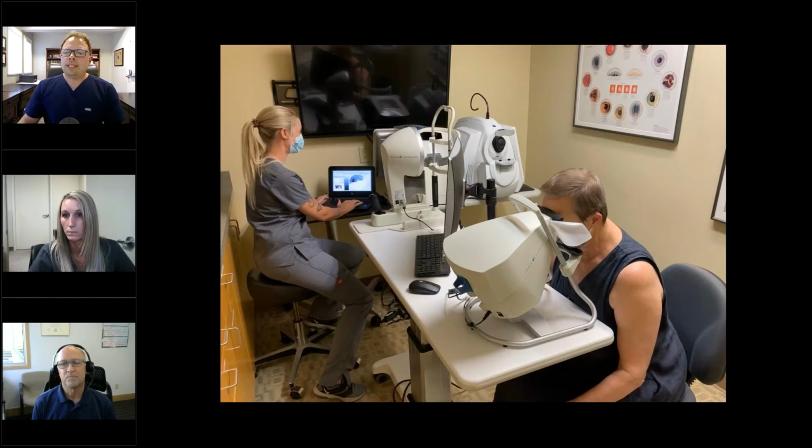Yeah, so anytime we're going to bring in a new instrument, we want to create a new workflow that will work. And that's crucial for on-demand perimetry. You just have to be prepared for it. Brandy and I did quite a bit of talking and thinking about what we were doing before, or at the time, currently.